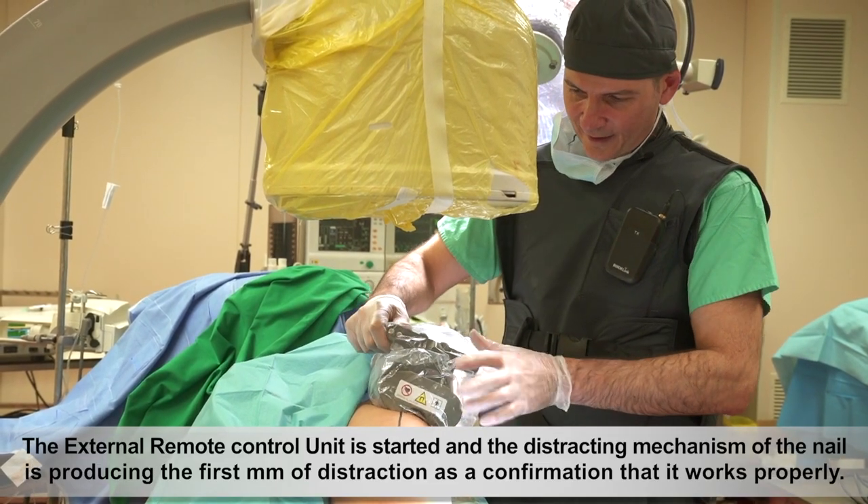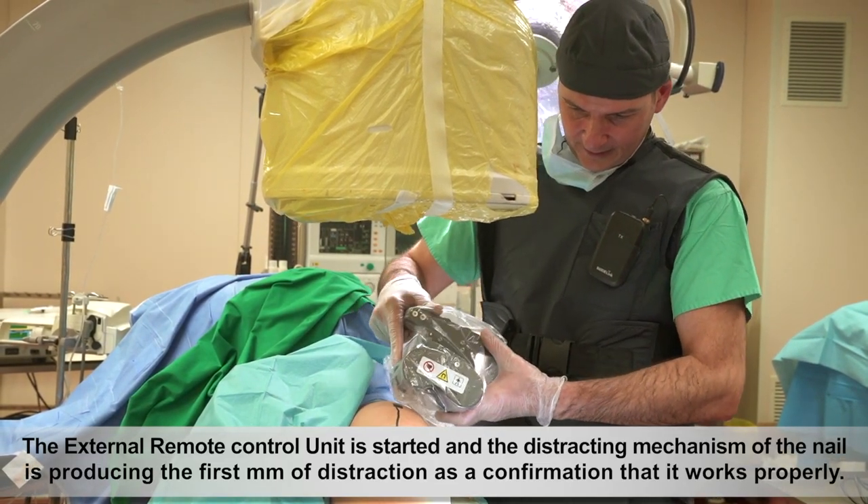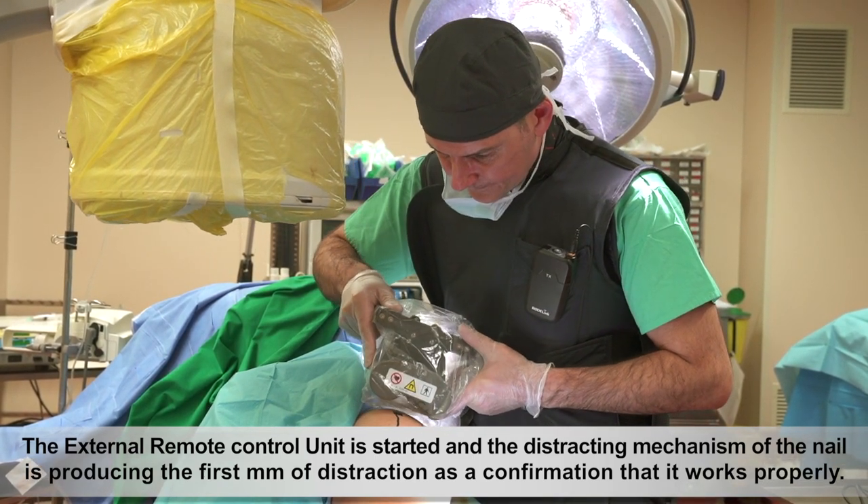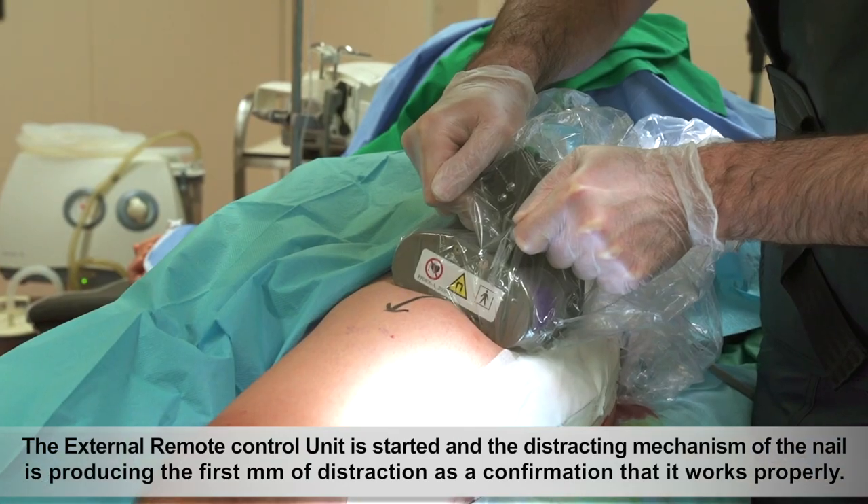The external remote control unit is started and the distracting mechanism of the nail produces the first millimetre of distraction as a confirmation that it works properly.